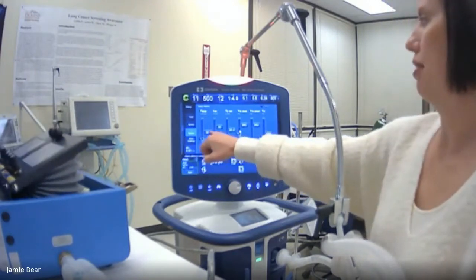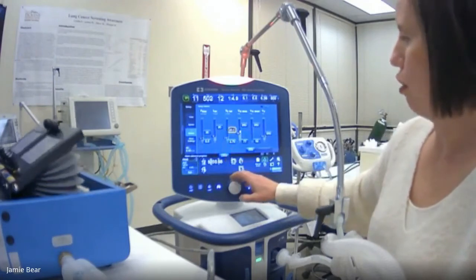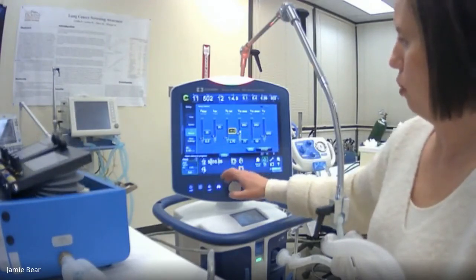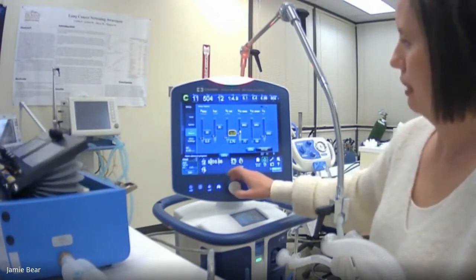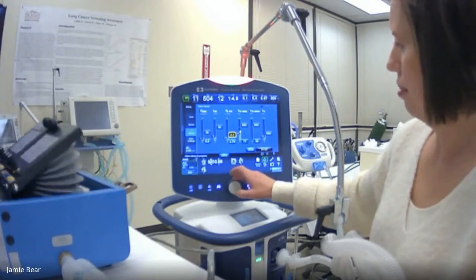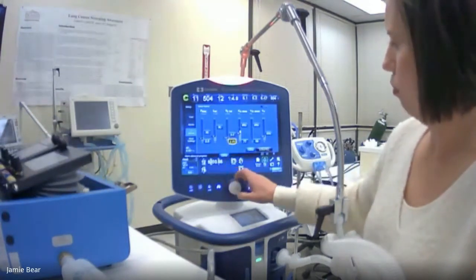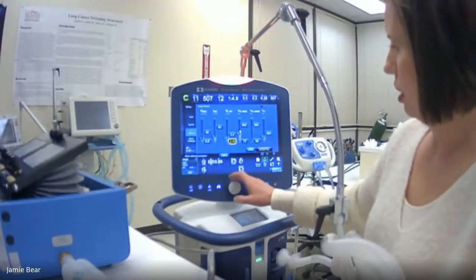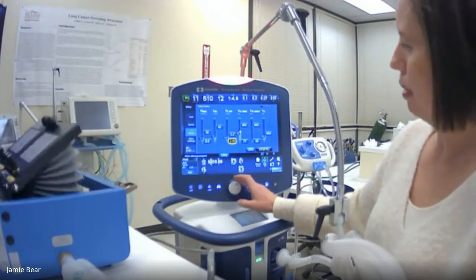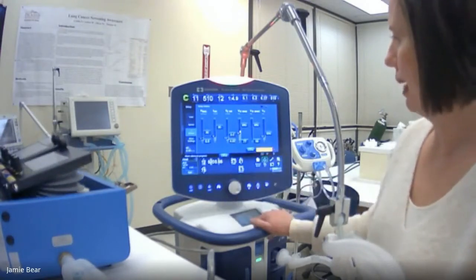We have our peak here at 30, and then we have our minute ventilation. So our total minute ventilation, we're getting about 6.86, so we'll say 7. So we'll put that at 9. Okay, and if that's 7, we'll say 6. We'll be really tight and put it at 4 and 9. And yes, I know I'm probably being more careful than you are at clinical, but can't hurt.